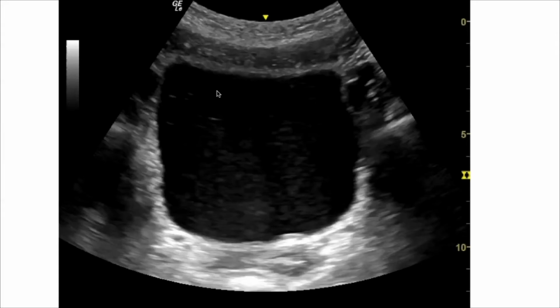So here is an image that kind of depicts some of the different types of contractions you'll see when asking a patient to perform a pelvic floor contraction. Up top, you'll see a normal levator plate elevation. Over to the next side, you won't see any levator plate elevation.